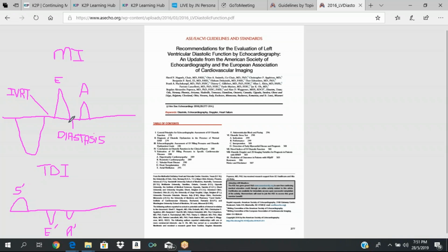But when the diastolic dysfunction gets more severe, the atrium gets bigger and bigger. Okay? So the atrium gets larger and larger the worse the diastolic dysfunction. Also, the TR velocity, the pulmonary pressures.